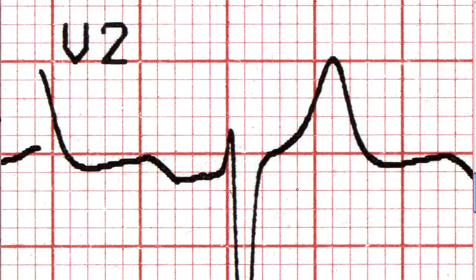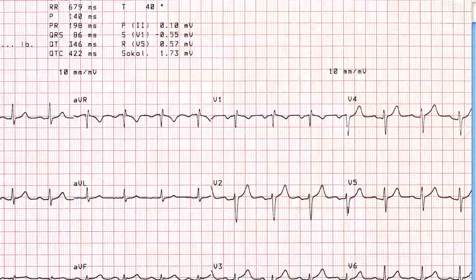So having said all that, let's get back to looking at ECGs as one of the most important tests you can do on a patient with heart disease. And this applies, of course, to cardiac monitors that you'll find on an ambulance, in the emergency room, in the coronary care unit. And my purpose here is to make sure you know exactly what you're looking at and get the diagnosis right.